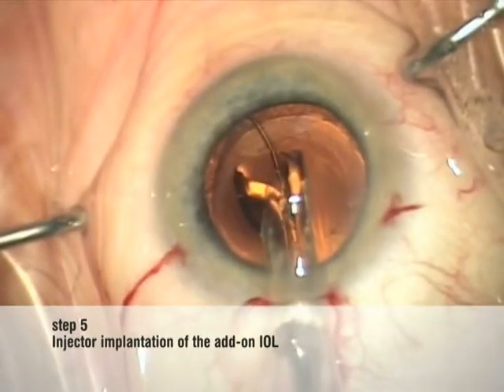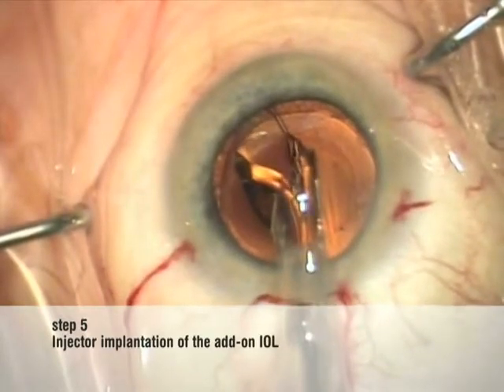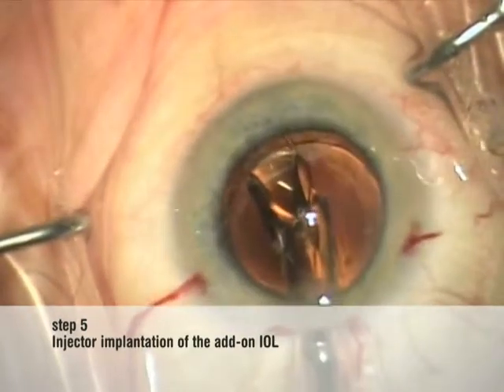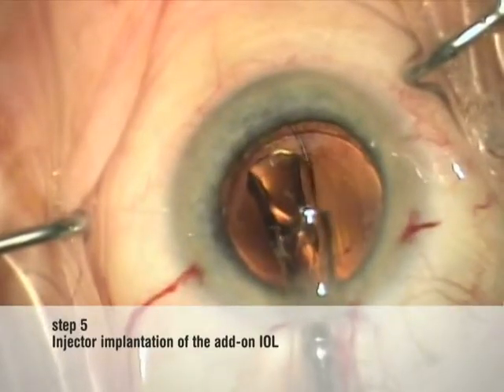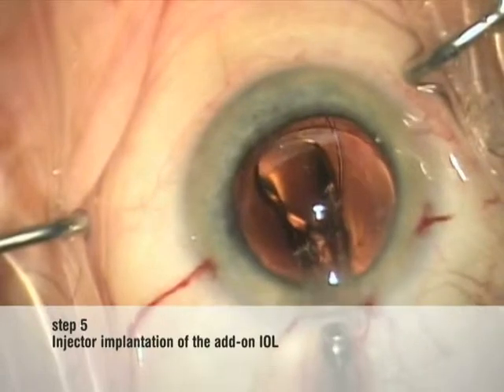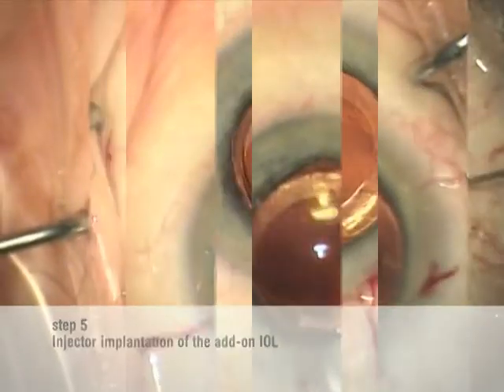The injector stamp is moved forward slowly in a stop-and-go manner to let the optic unfold corresponding to its own material elasticity. In doing so the second haptic unfolds automatically and can easily be dialed into the sulcus as well.